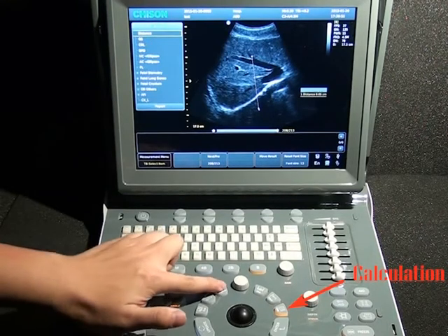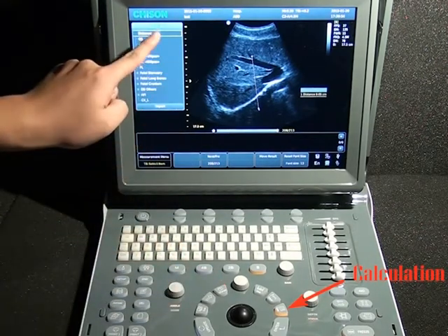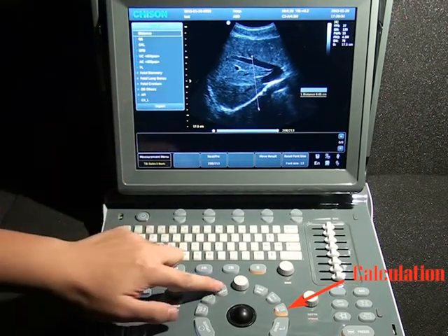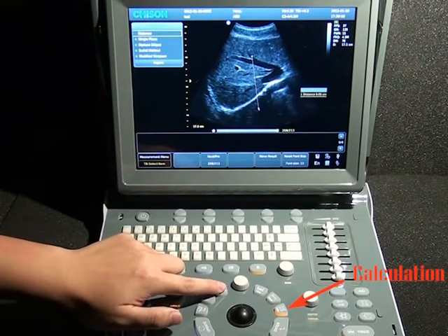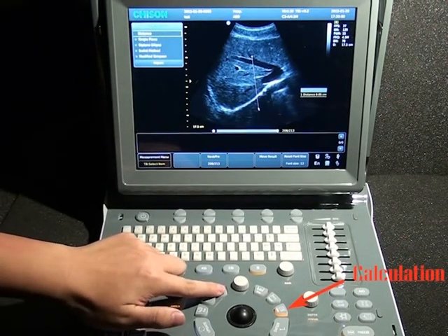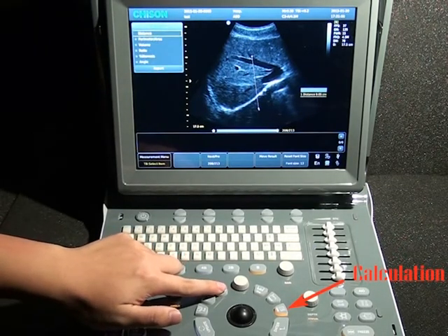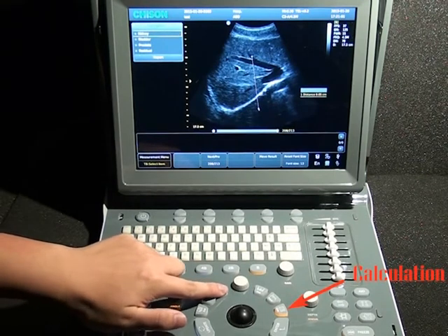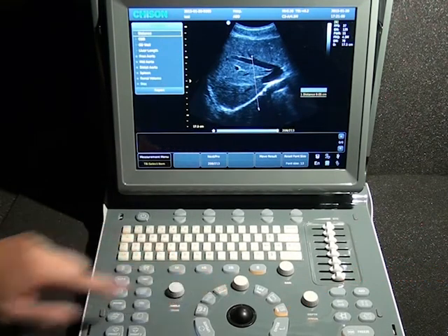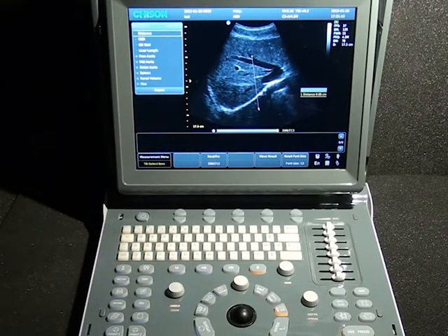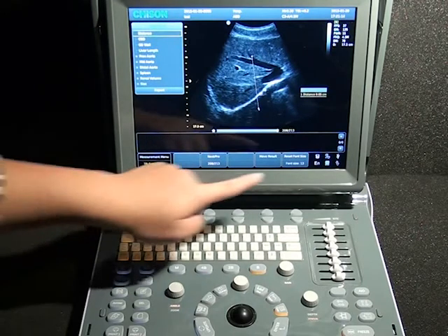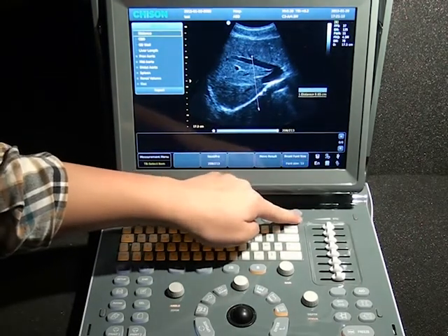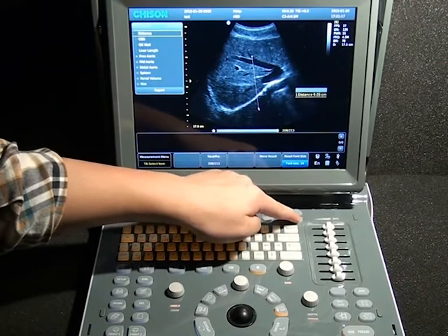Press Change to switch the CAC menu. We have OB, GYN, cardiac URO, small parts, paediatrics, and vascular. Worth mentioning is that we can also adjust the font size and the position of the result.